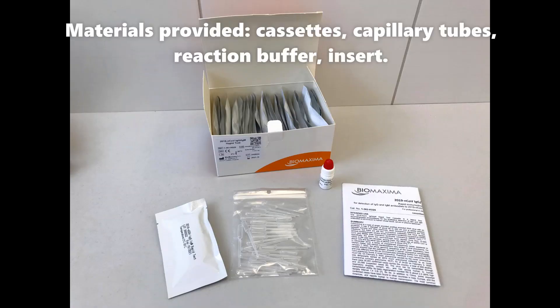Materials provided: cassettes, capillary tubes, reaction buffer, and insert.